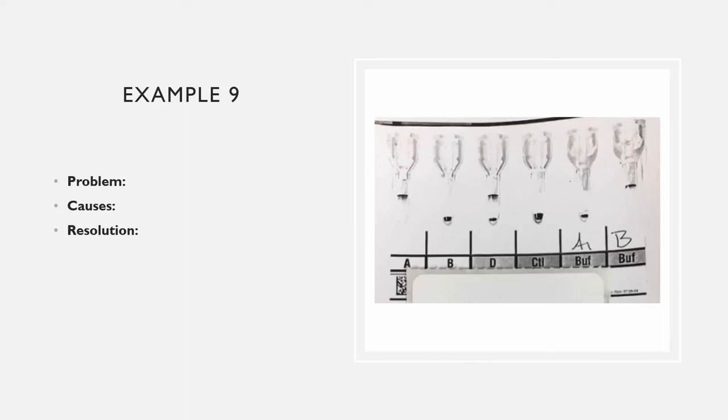So if you have a monoclonal anti-D, it could just be specific to epitope 3. So if you have one of the partial Ds, it's not going to detect a partial D. But if you have a blend of D, it's going to have anti-1, anti-3, and these are not real names.